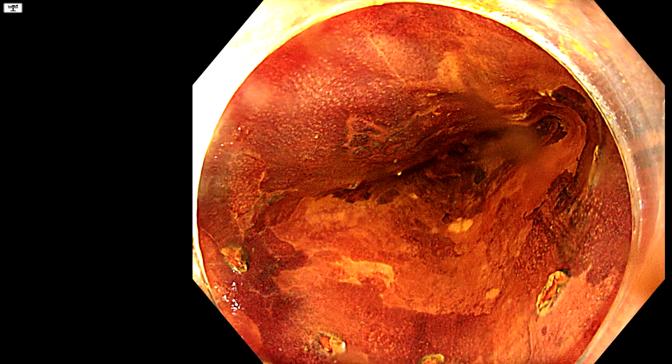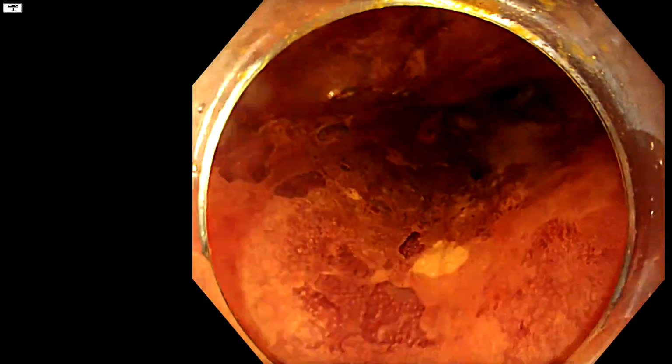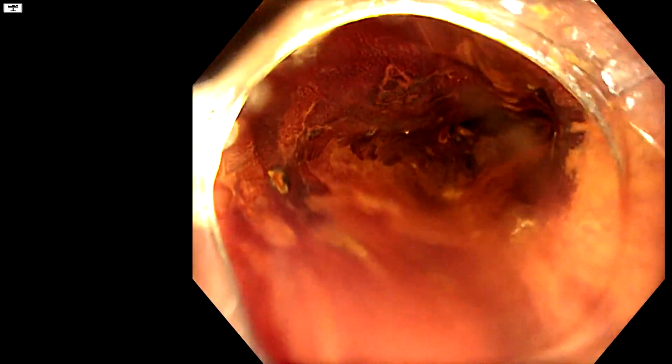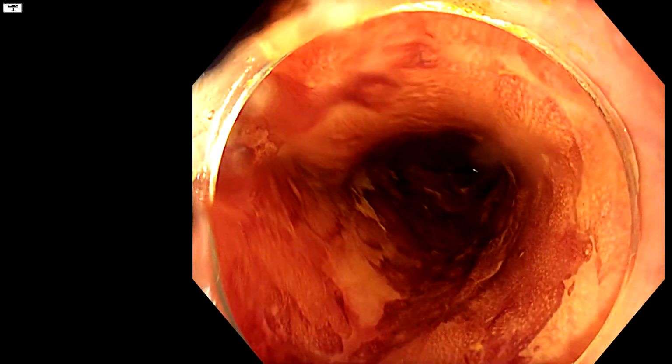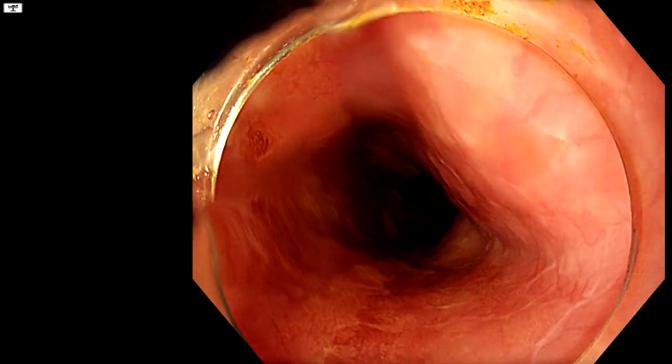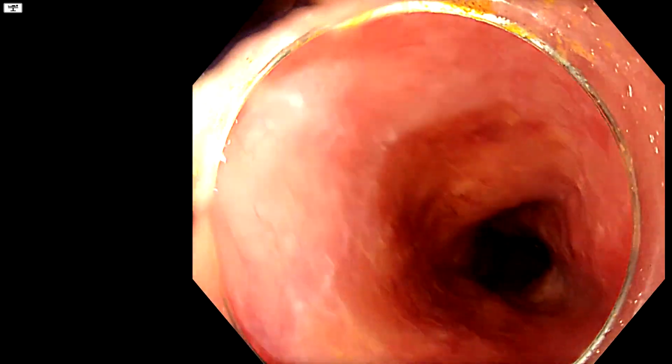So we just freeze it here, you have kind of a bull's head shape with a horns area centered on that little, what looks like a dot but is not a dot, is a bit of keratinosis, I think, here. Within the dots, I think this is the main area of abnormality. You also have lots of different areas out here, which could be something, could be nothing, but are almost certainly unstained.